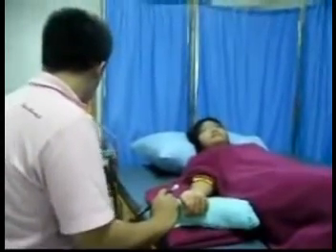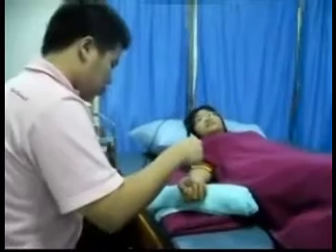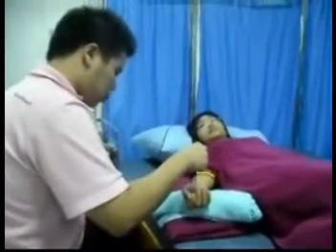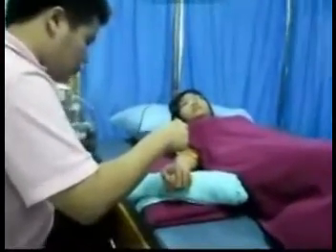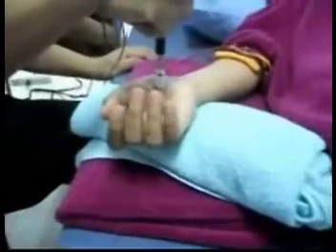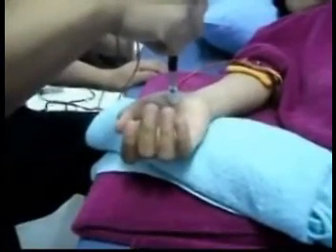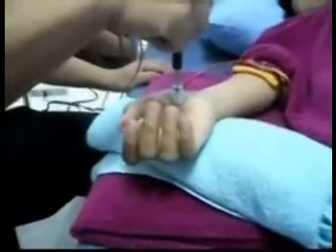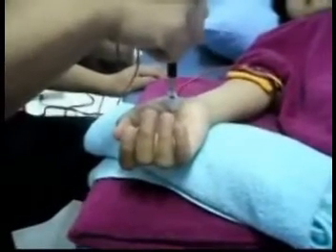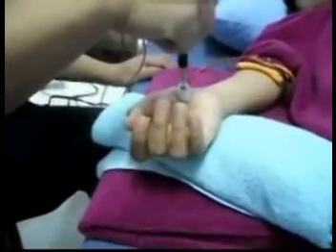4.3 Operate the instrument at the set parameters: pulse duration, pulse interval, and treatment time. 4.4 Firmly contact the point electrode at the motor point of the muscle. 4.5 Slowly turn on the intensity and observe the response of muscle contraction. 4.6 Firmly slide the point electrode to another muscle. 4.7 In case of a temporary stop, slowly turn the intensity off to the 0 position in order to prevent danger from electrical current.